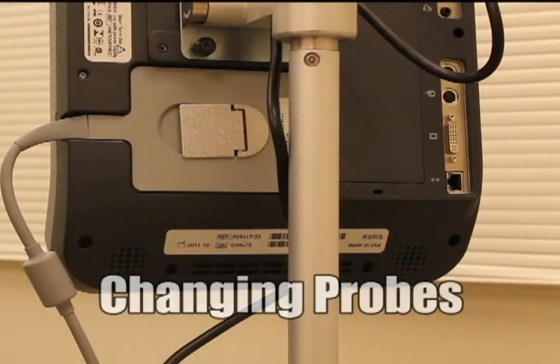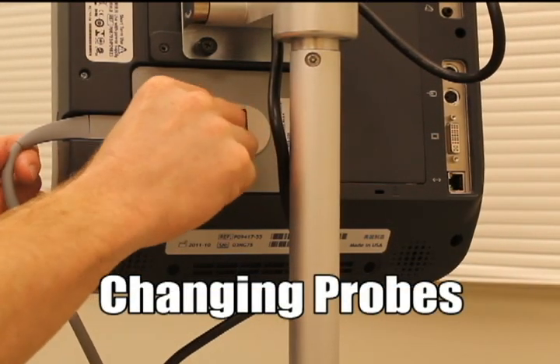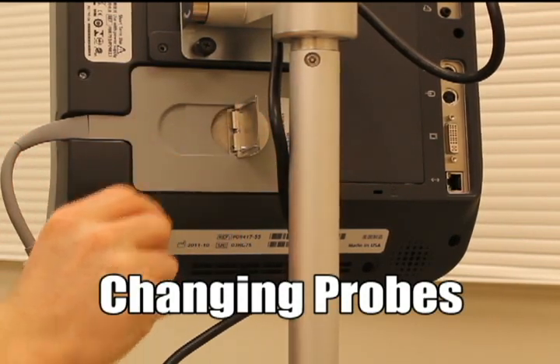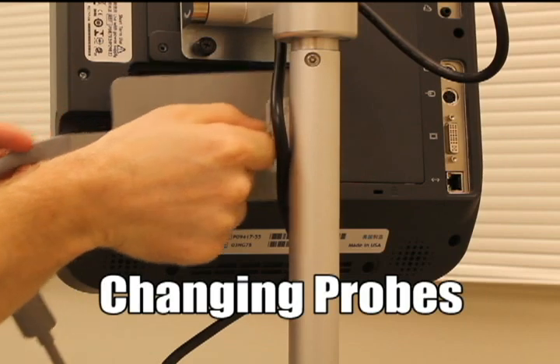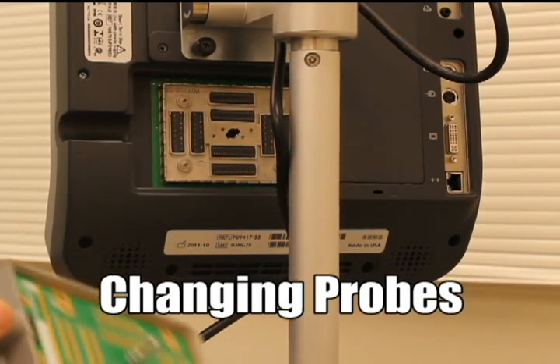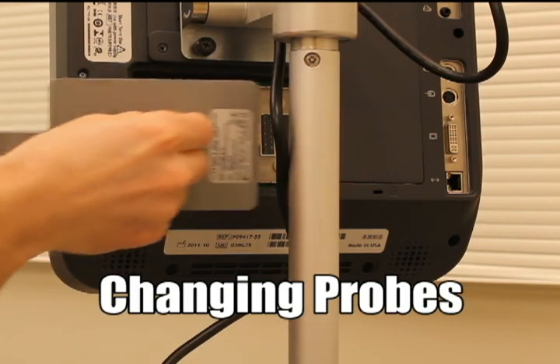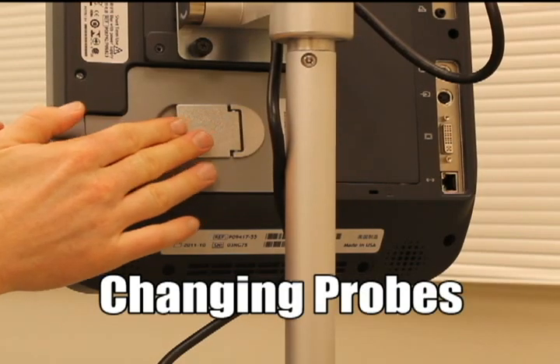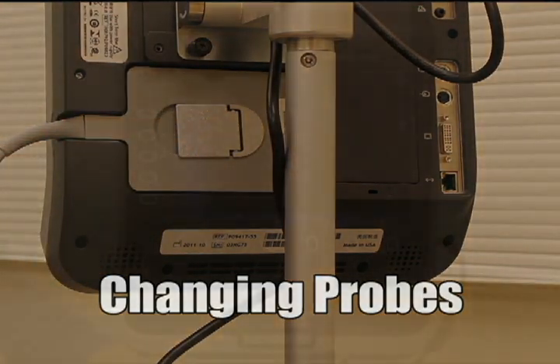Once you've chosen the probe, you need to know how to attach it correctly. Right now the linear probe is in place. If we want to switch it out for the cardiac probe, we lift up the bar on the back of the machine, twist it, and it comes right out. We take the new probe, place it in, twist, and lock it into place — very simple.